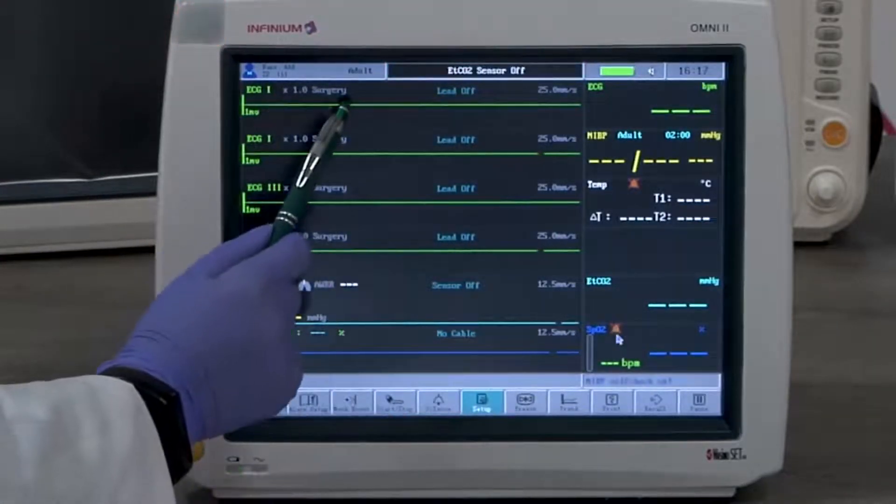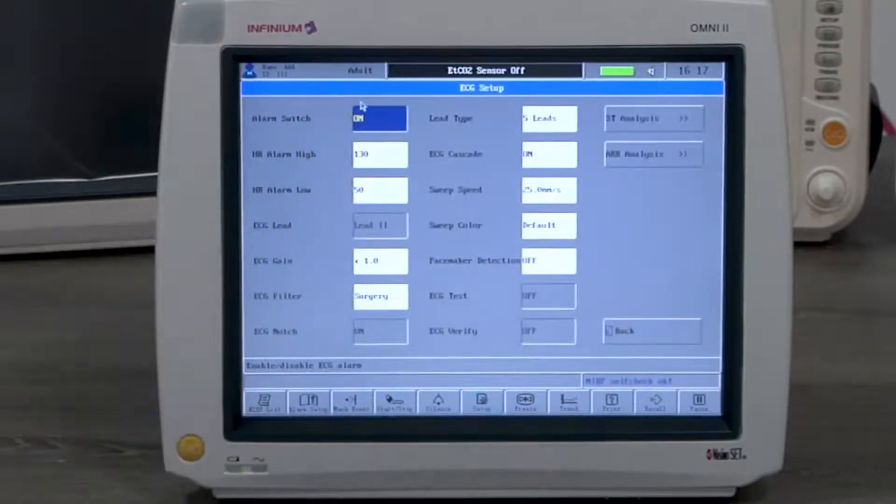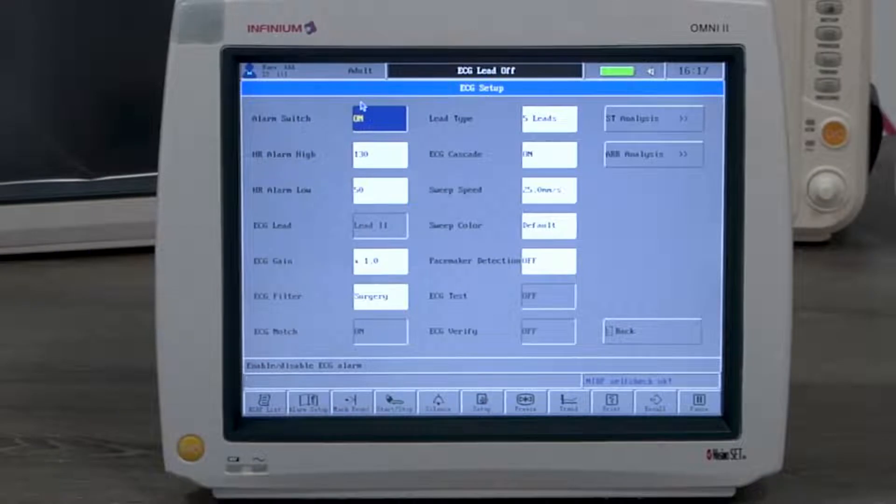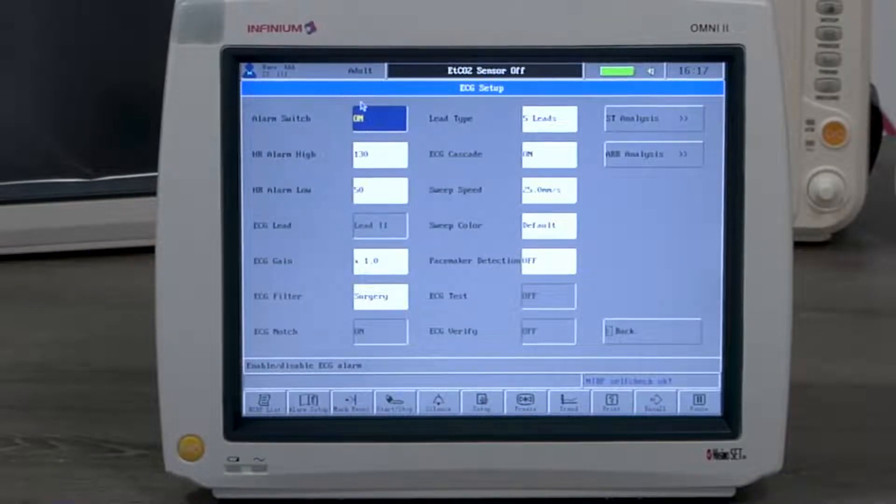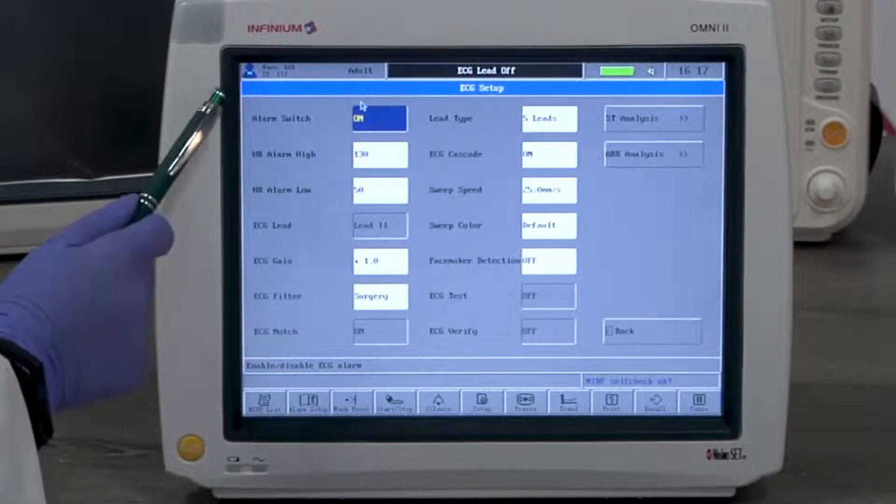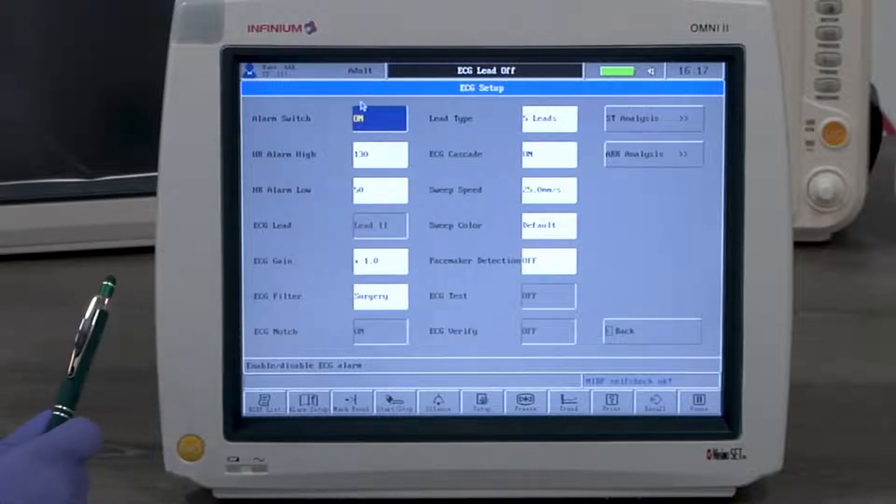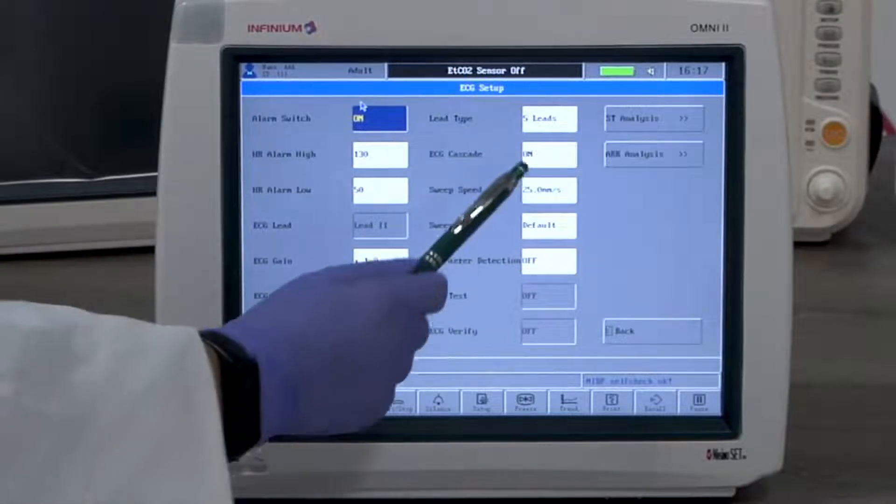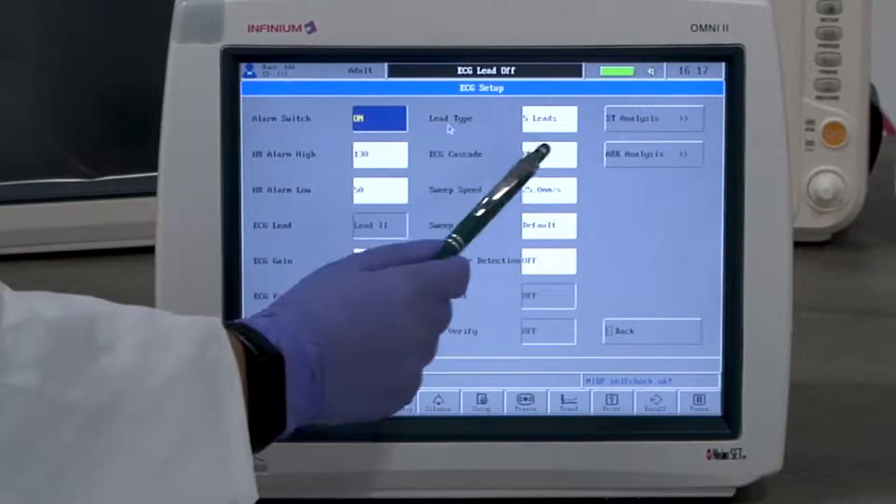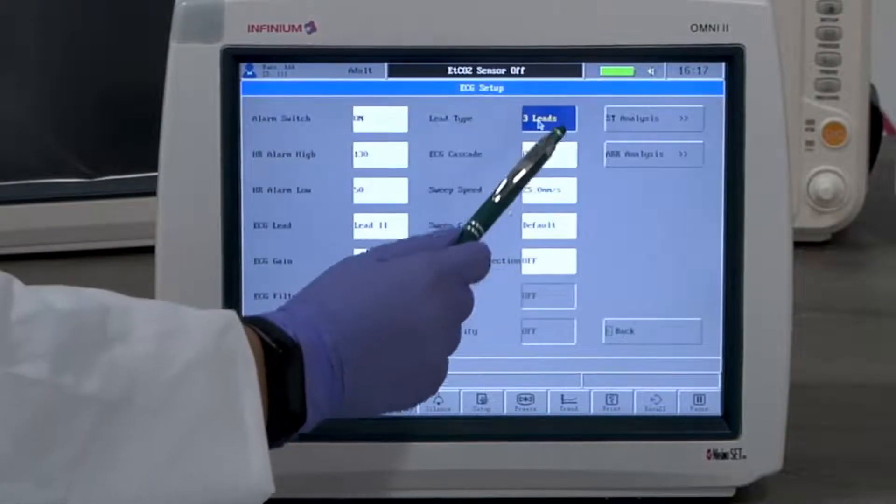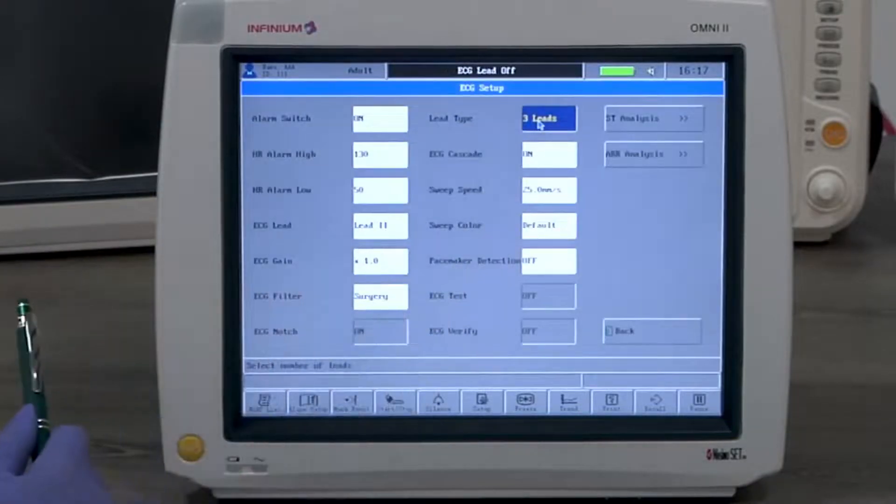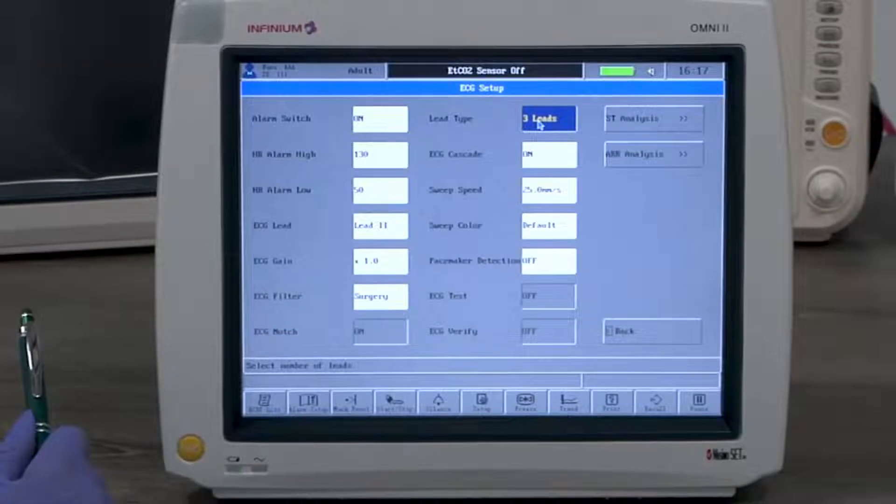By tapping on any ECG window, you will enter the ECG menu. Here you can change all available settings to fit your needs. The lead type option allows you to choose the ECG to be either 5 lead or 3 lead.